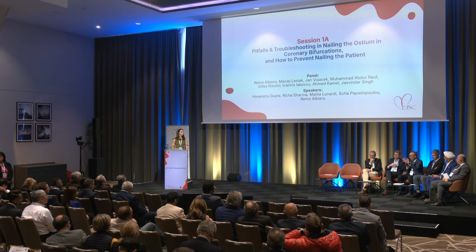So I answer your question. First, I would have done the same strategy. Usually you don't want to compromise the LAD when you do preparation. With Shockwave you have 2 wires. You don't have to remove the wire, as you would with rotablation or atherectomy, and so you have access to both branches.